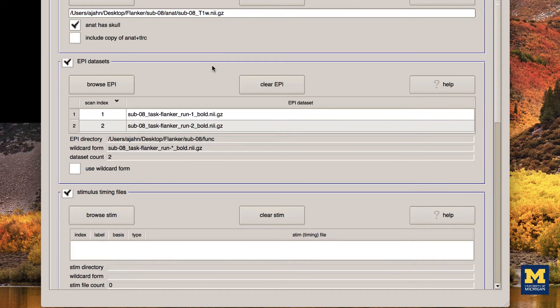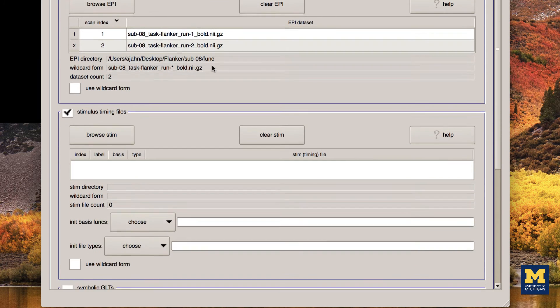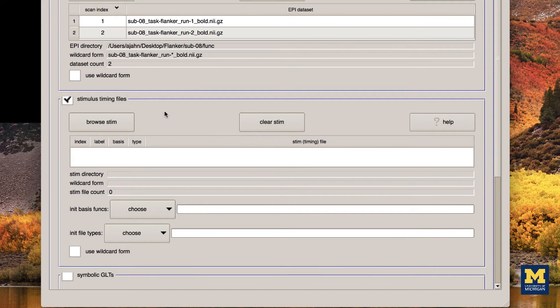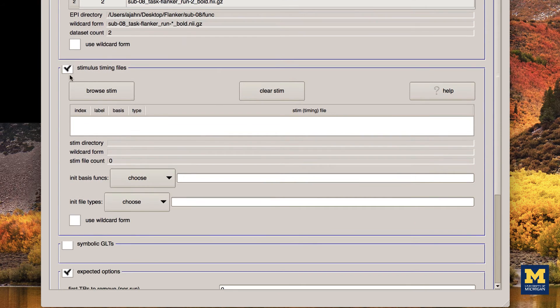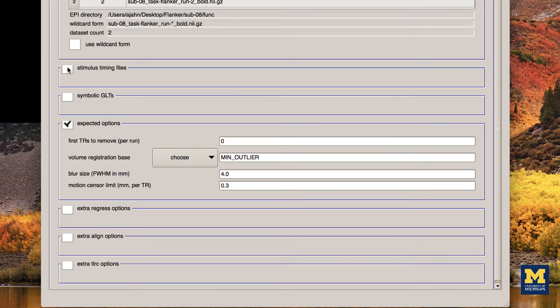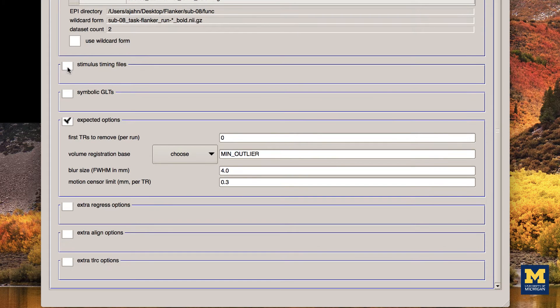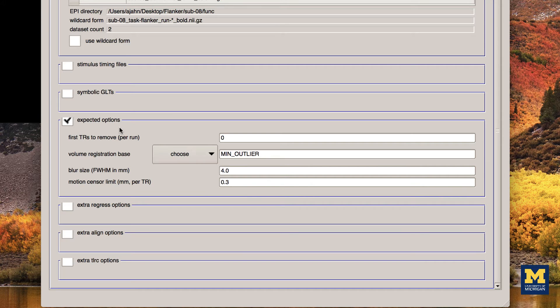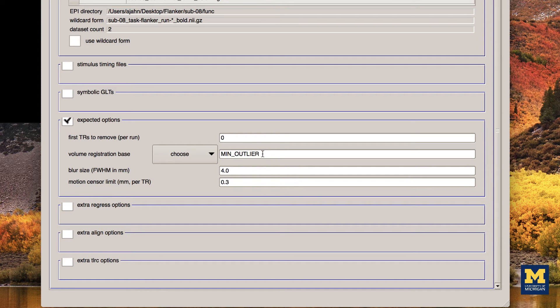We are going to ignore the Stimulus Timing files and Symbolic GLTs sections. We'll come back to them when we do Regression. The default values in the Expected Options field are fine as they are. No TRs will be removed. The volume with the least amount of variability will be used as the reference image for alignment. A smoothing kernel of 4mm will also be applied to the data.